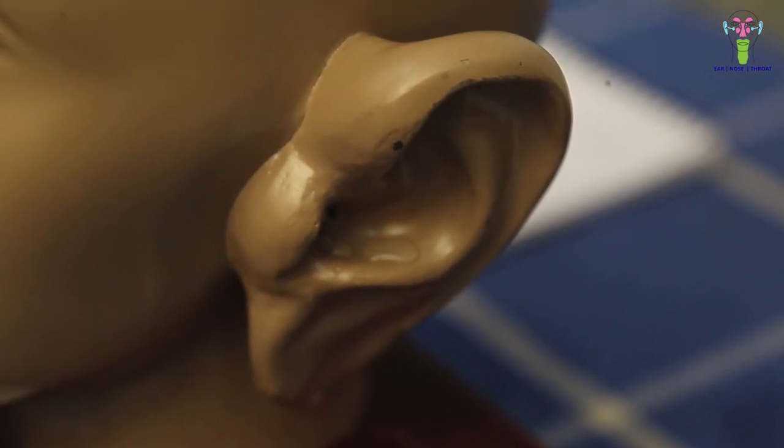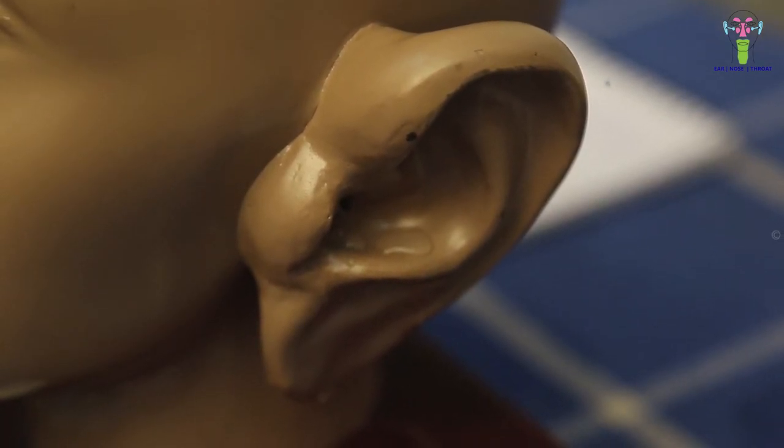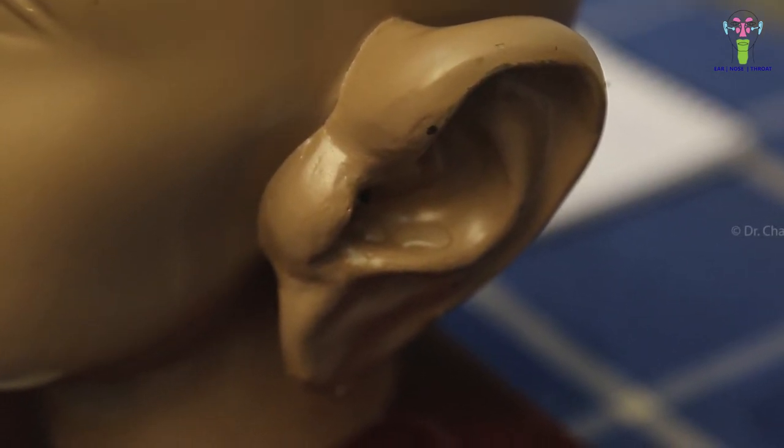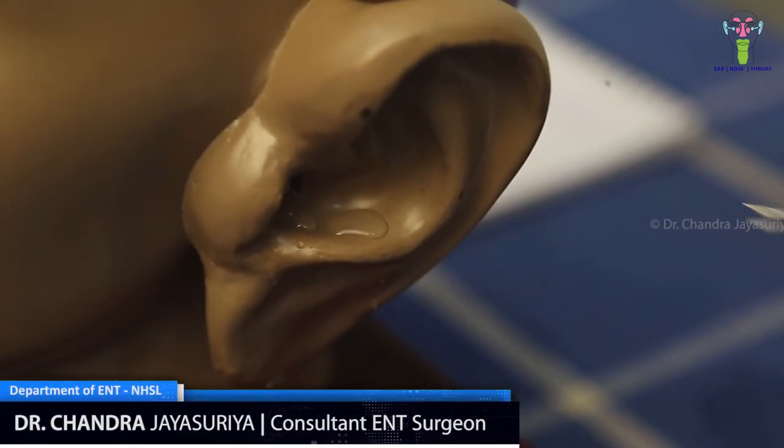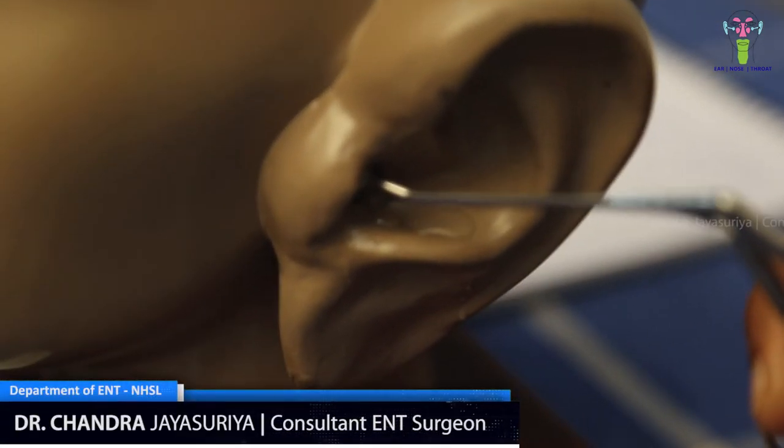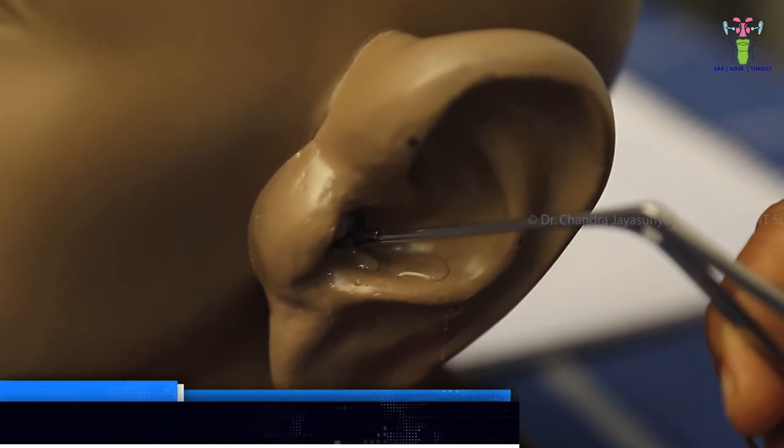It is very easy to put the drugs on this dressing, so it's a very easy way of delivering drugs into the ear canal. When the patient comes after few days when the canal edema settles, we can remove this.